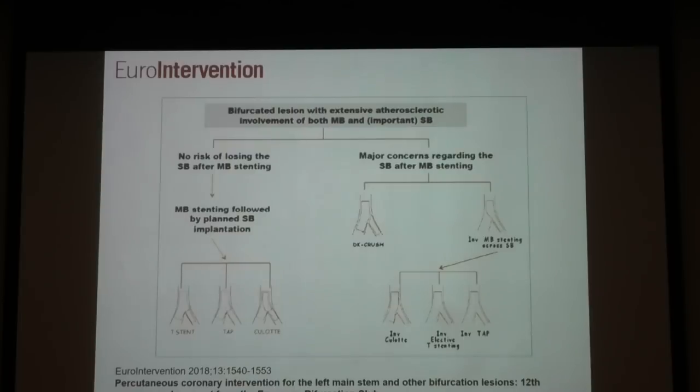هلا في بعض الحالات بتزبطش فيها الروتين سواء تي ستنتينج ولا موديفايد كراينا تكنيك ولا الكلوت ولا دي كي كراش تكنيك ما بزبطش فيها. So you have to know all of them, but they are usually used in a selected group and small number of patients.